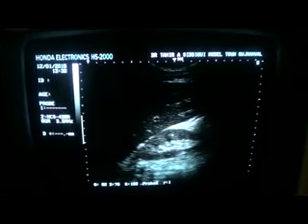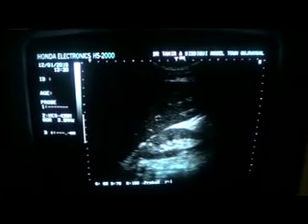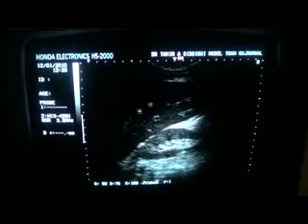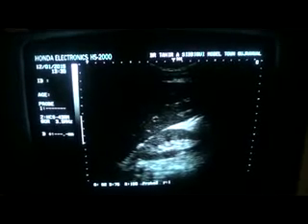This is a short video segment to make you aware of an important fact — the echogenicity of the liver and that of the kidney. The echogenicity of the renal parenchyma should be either equal to that of the liver or less than that of the adjacent liver parenchyma.